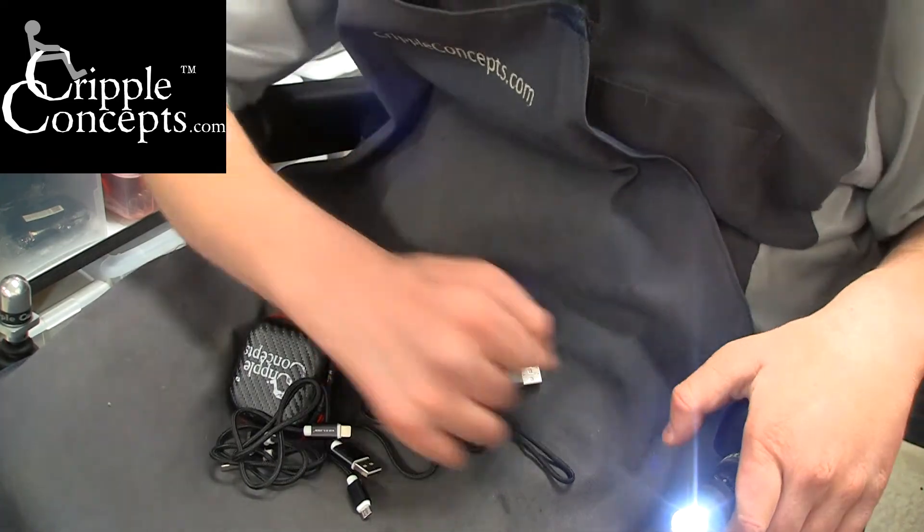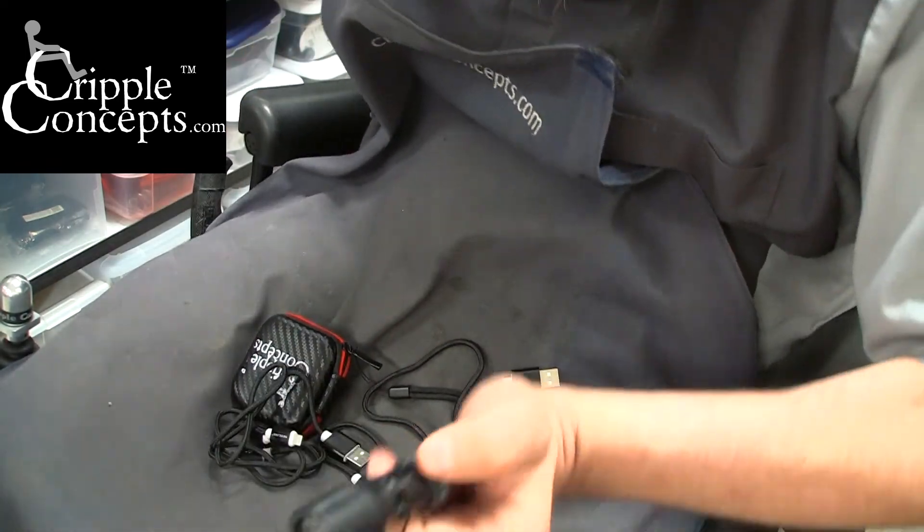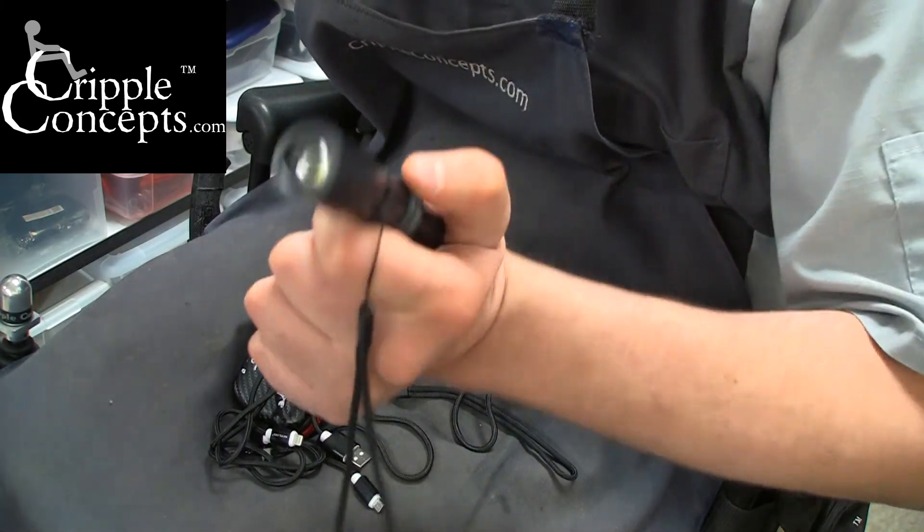They're compact, they're easy to use — a basic, simple, functional charging device.